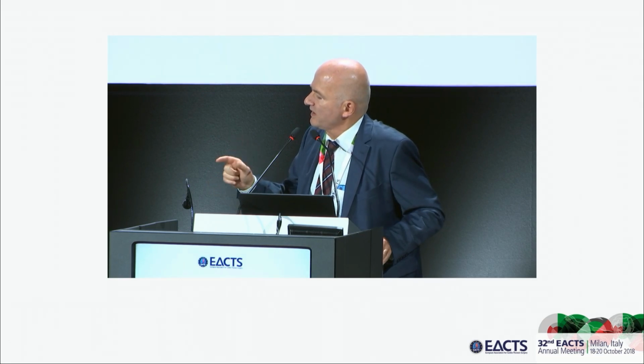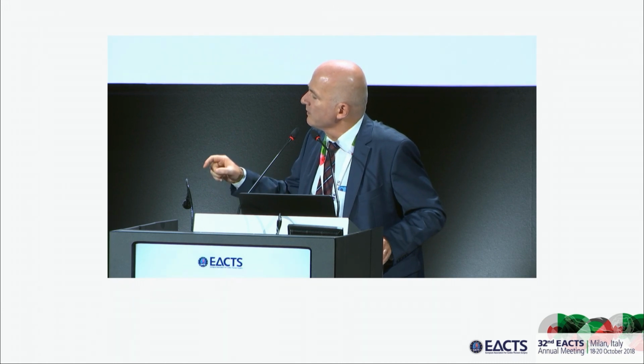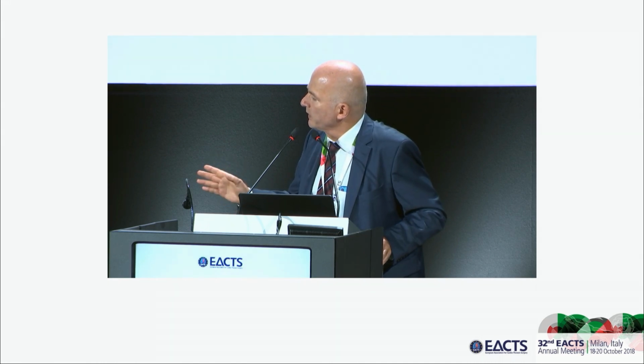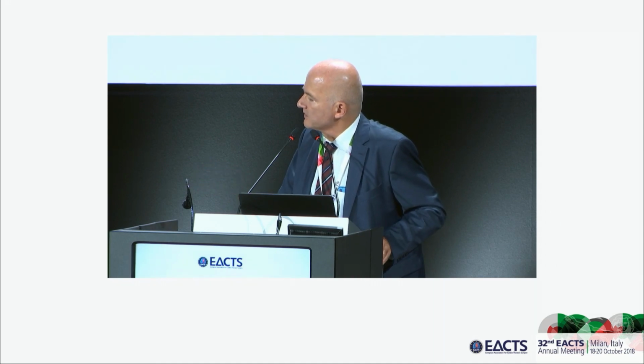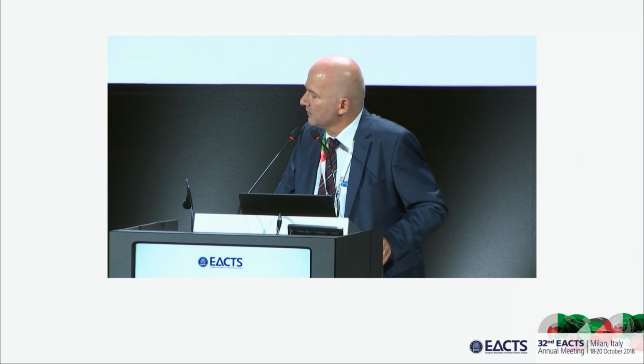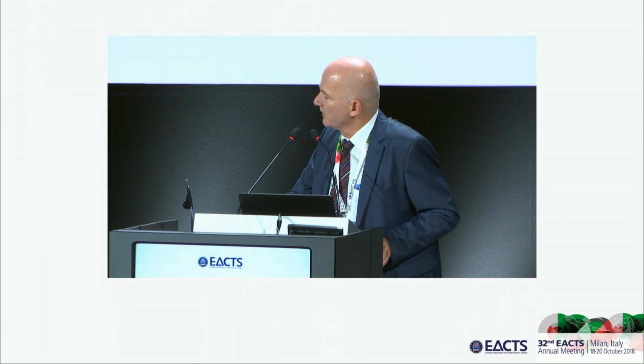In the subsets in which I'm uncertain, and this refers to remodeling, for instance, in bicuspid valve, where it is very easy to achieve perfect valve configuration, I'm now switching. I'm doing the surgical equivalent of a prospective randomized study. That is, I leave it up to the democratic decision of the team whether we do an annuloplasty or not.